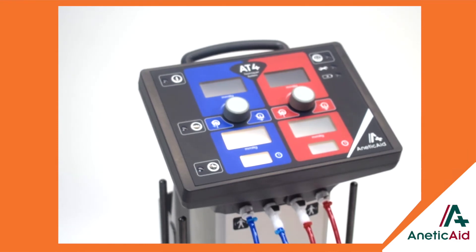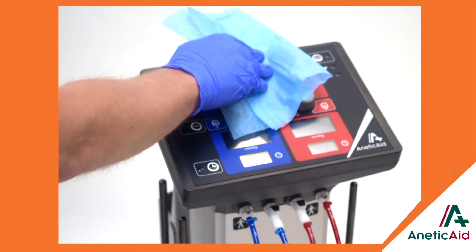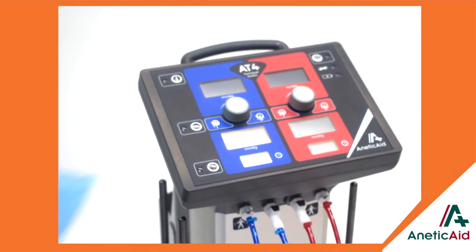The materials used in the construction of the AT4 have been specifically selected to aid infection control. It can be cleaned using mild detergent and disinfected using isopropyl alcohol, sodium hypochlorite, or quaternary-based products.